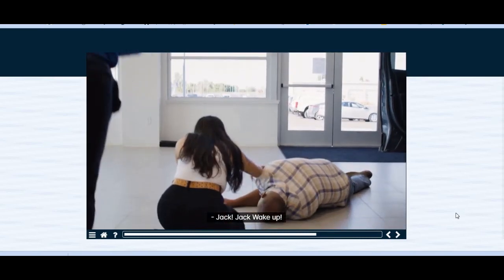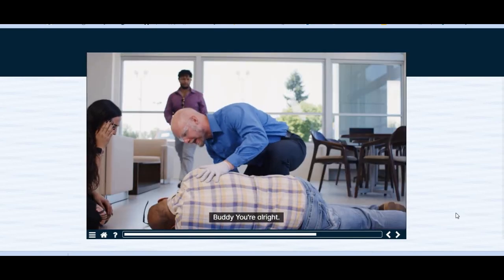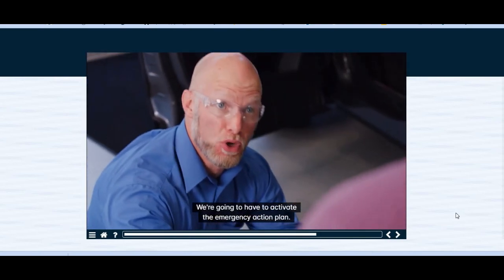Jack! Jack, wake up. Jack! Hey, buddy, you okay? Buddy, you alright? Jack! Alright, we're gonna have to activate the emergency action plan. Get me an AED and a first aid kit.